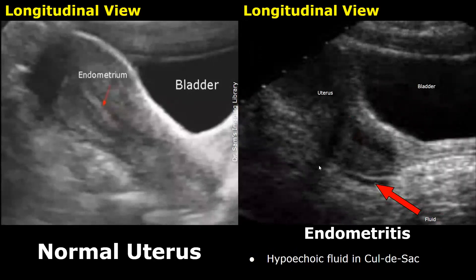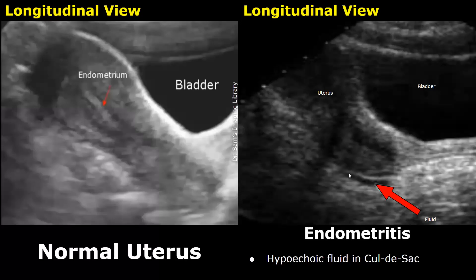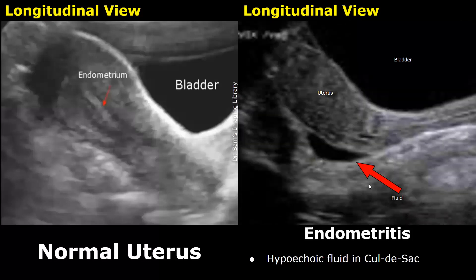The cul-de-sac is the region behind the uterus in this image. Normally it does not contain any hypoechoic fluid; however, in some cases a minimal amount of fluid is normal. Endometritis can lead to accumulation of fluid in the cul-de-sac. Here we can see hypoechoic fluid in the cul-de-sac posterior to the uterus. Here is another image showing a significant amount of fluid in the cul-de-sac. This feature is not specific to endometritis but is commonly seen in such cases when clinically correlated.